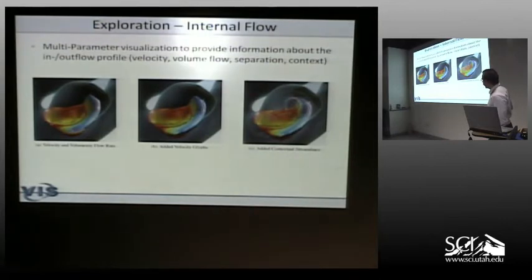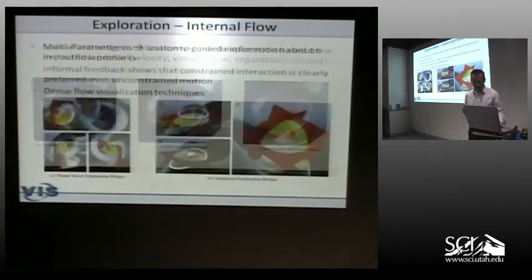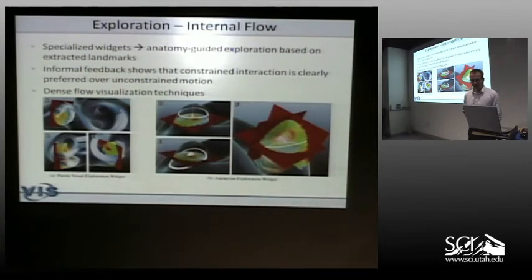That was the idea of separating the ostium plane in the inflow and outflow region. And on this plane, we added more and more features to reveal further details of the flow we have simulated. And at least with this image, we are overboard. That is something which is too complex for the new radiologists, which the evaluation clearly could show.